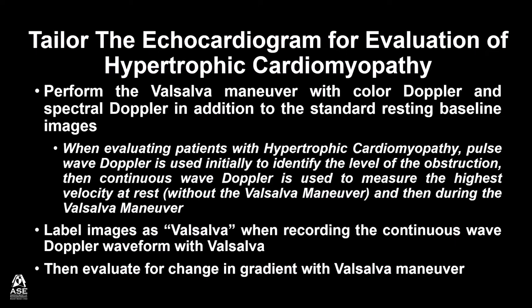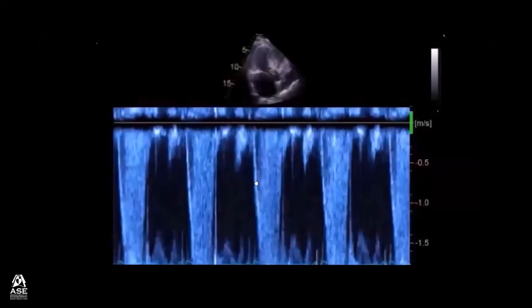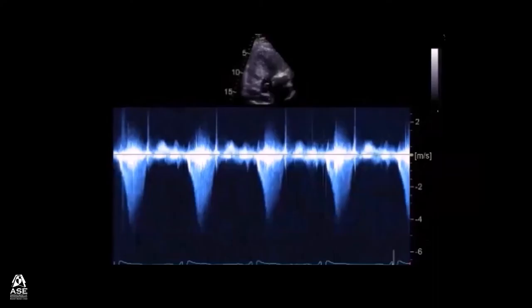Then continuous wave Doppler is used to measure the highest velocity at rest without the Valsalva Maneuver and then during the Valsalva Maneuver. Label the images as Valsalva when recording the continuous wave Doppler waveform with Valsalva. Then evaluate for change in gradient with Valsalva Maneuver. This is an example of pulsed wave Doppler identifying the level of obstruction, then switching to continuous wave Doppler to record the highest velocity.